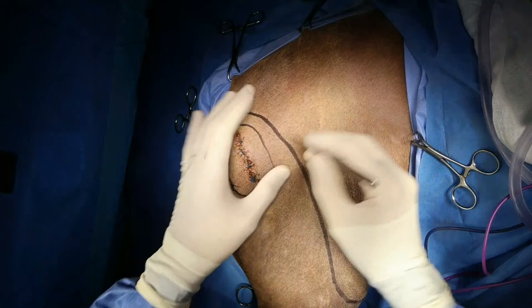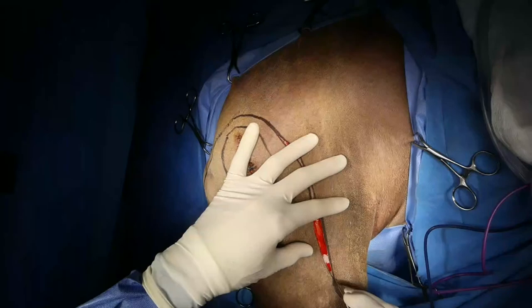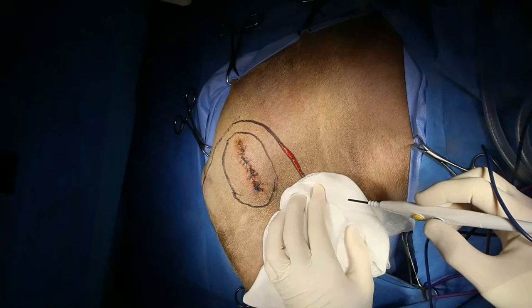Can we get some extra towel clamps, please? And just confirming our cautery is plugged in. And can we get coag and cut on 40, please? Thank you.